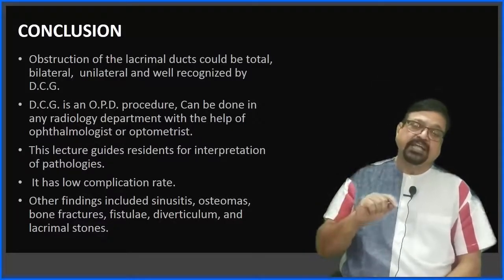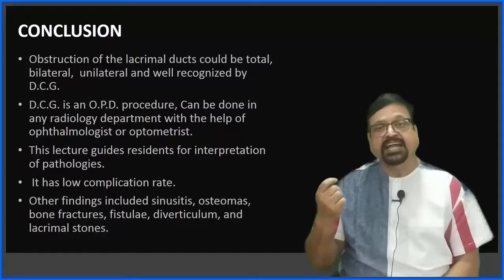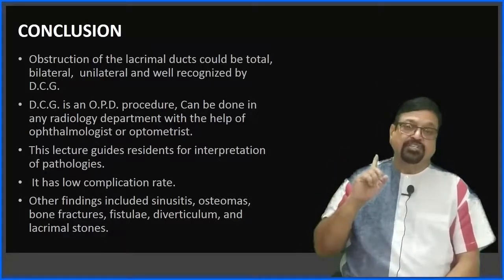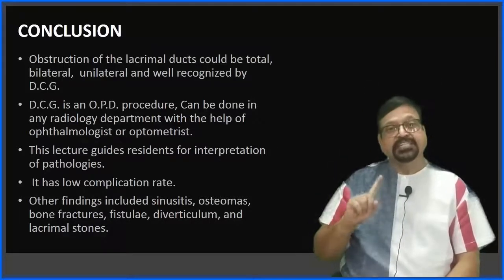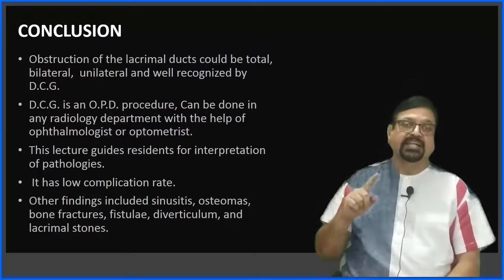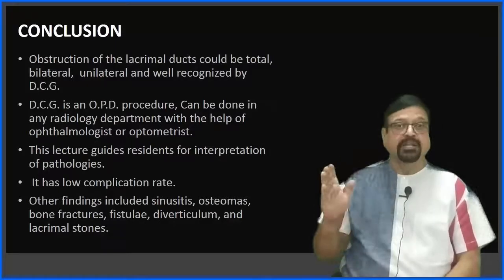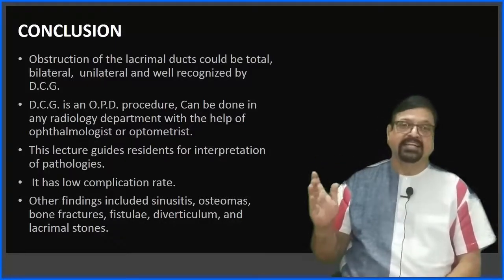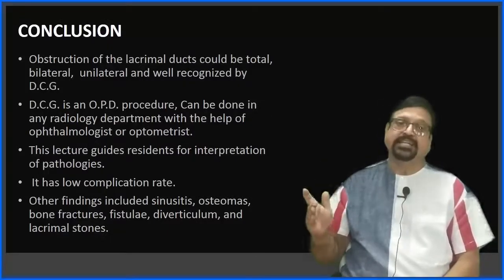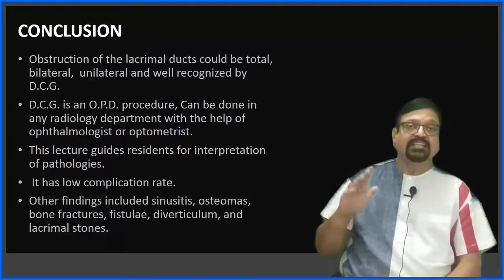Then after the puncta, usually the inferior canaliculus is cannulated and a dye is injected, and we are taking a picture. Suppose the dye which is injected from the inferior canaliculus comes out from the superior. Now the conclusion is different. We are getting a block proximal to the lacrimal sac. Now, is the patient feeling a bitter taste or not? If the patient is feeling a bitter taste, that means usually there is a patency.